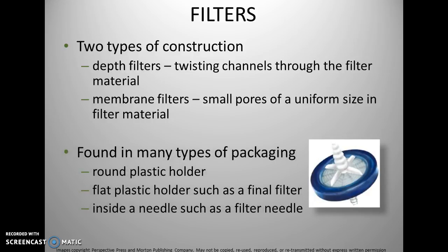Okay, found in many types of packaging. Round plastic holders, flat plastic holders such as a filter, and inside a needle such as a filter needle. So here is an example of what we find as a filter.